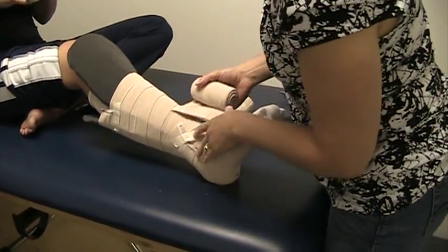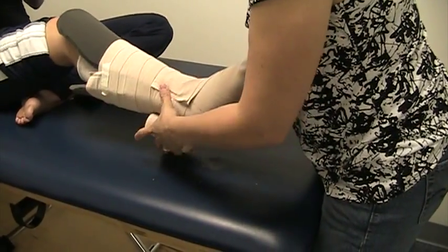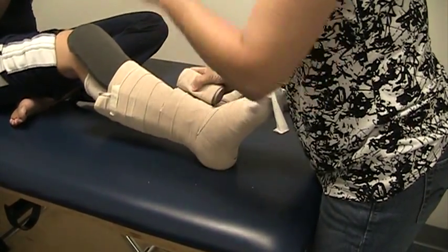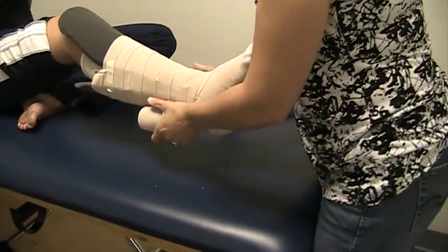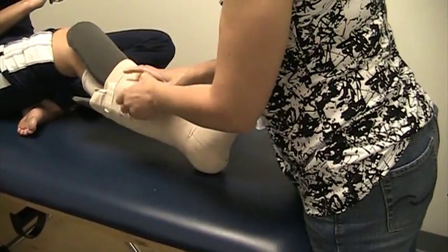The next will again be applied in the opposite direction, anchoring at the ankle again. This is a ten-centimeter bandage with a half overlap.